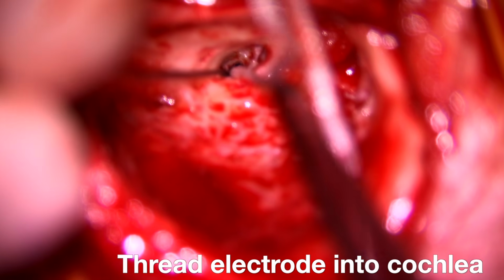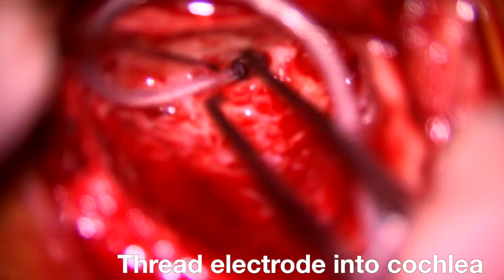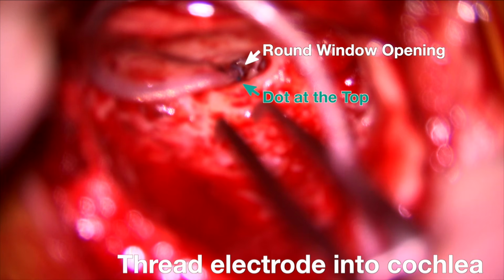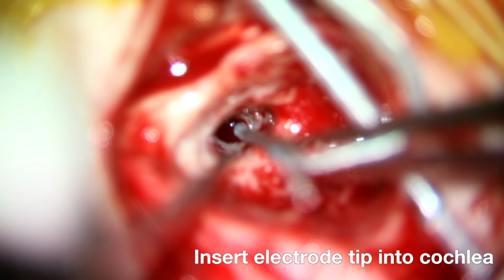Once you maneuver the tip of the implant into the round window, you slowly advance it until the dot is just outside the round window. You can see it clearly here now that the dot is at the top and hubbed at the round window, so we have a complete insertion in the correct orientation of this lateral wall electrode. For the stylet electrode, hopefully you can appreciate that this one is less flexible and a little bit more rigid, so it's easier to insert the tip into the round window niche.